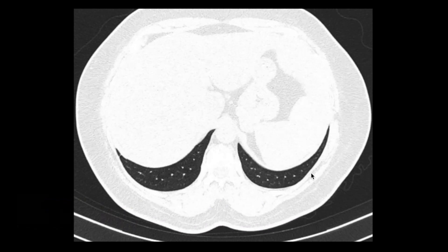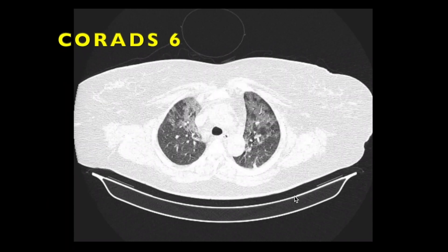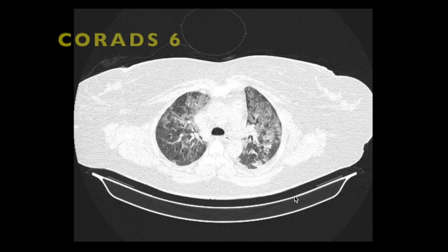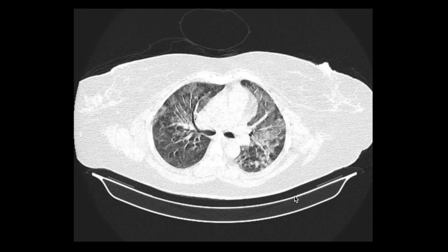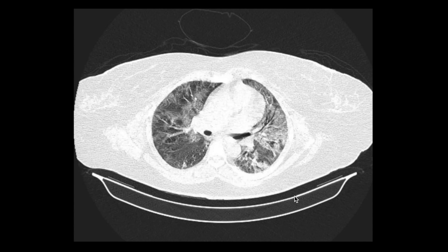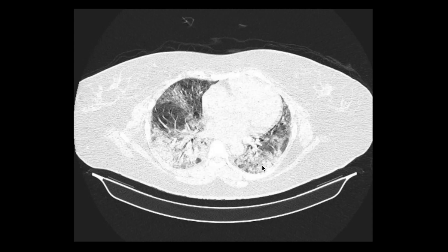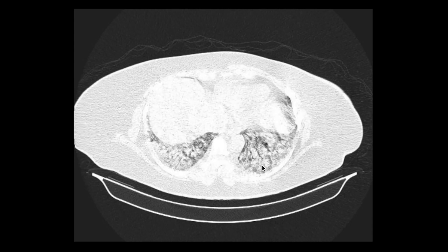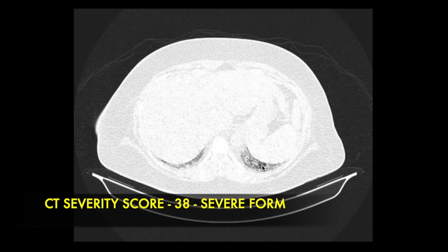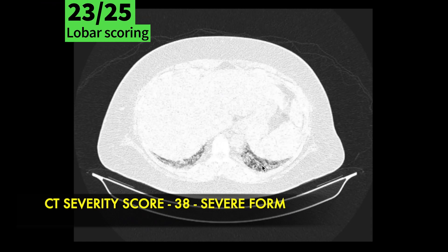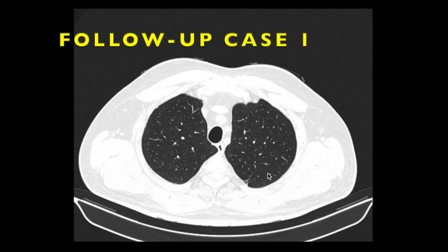This is an RT-PCR proven case of COVID-19 showing areas of ground glass opacities distributed bilaterally, involving almost all the segmental regions of both lungs, with areas of consolidation as well. This is a severe case of COVID-19, classified as CO-RADS 6 with a CT severity index of 38 out of 40.